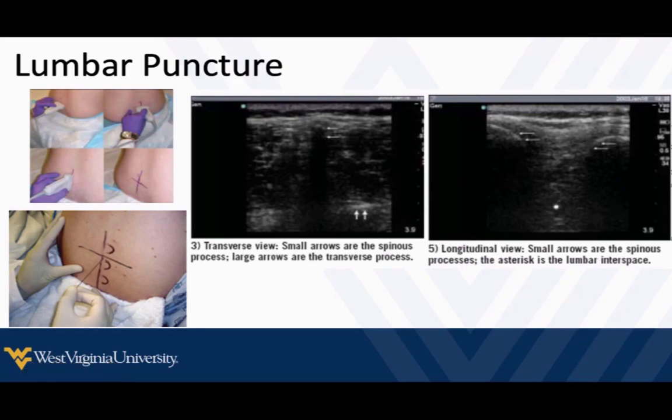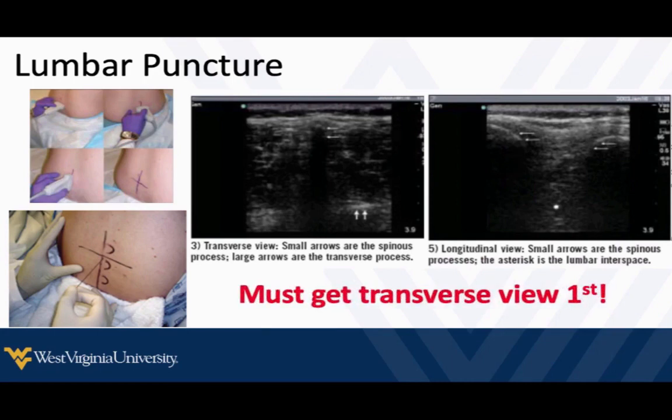There's lots of evidence showing this will help us in difficult patients, and even in patients that aren't difficult, literature shows we're still quicker, with fewer sticks and more success. Probably the most important thing is to get that transverse view first — it helps you find your midline and note the depth of the spinous processes.